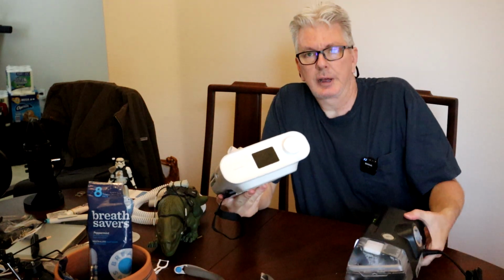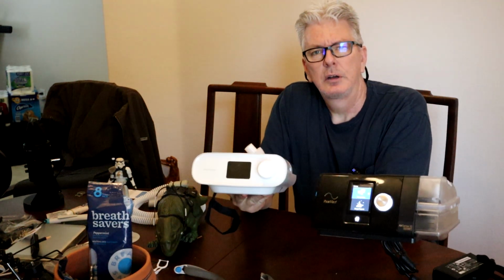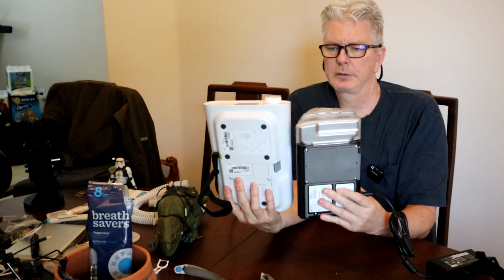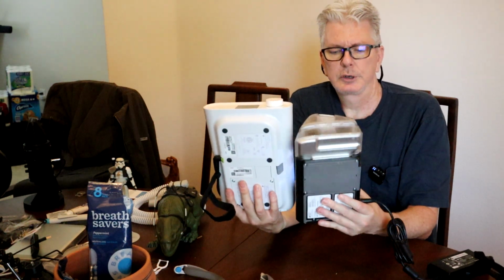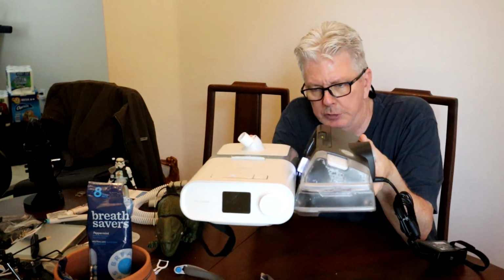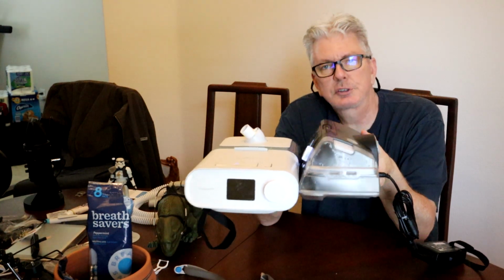The biggest difference right off the bat is that they are different shapes, and the Philips is probably about an inch longer than the ResMed, but as you can see, the Philips is also well over half the size, half the height of the ResMed. So the ResMed's taller and a little narrower too. If you look at just the width of the machines, the Philips is wider. Obviously, two different companies making two different machines, so they're very different.